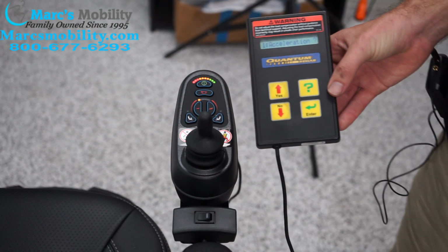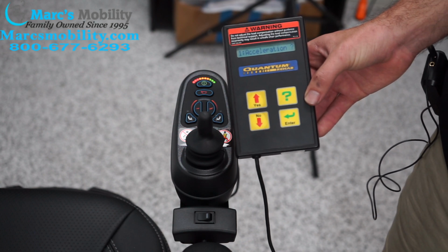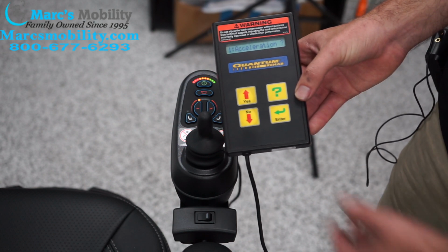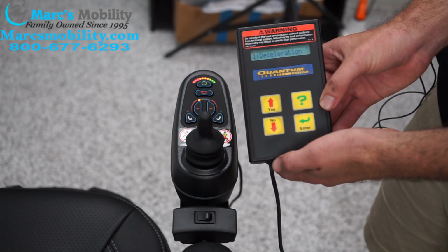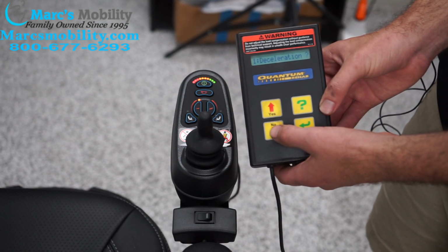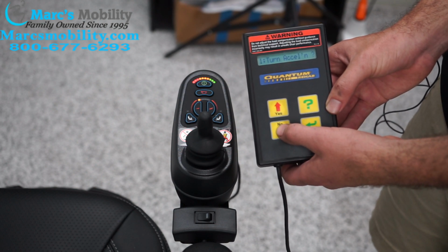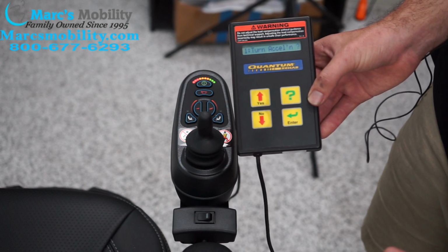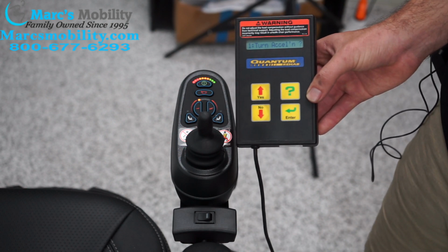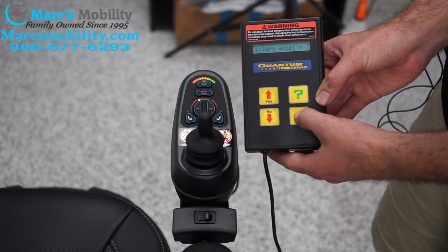So we have acceleration is the first thing you see. That is how fast the chair will get up to its maximum speed. We have deceleration, which is how fast the chair will stop when you let go of the joystick. We have turn acceleration, which is how fast the chair will get up to the top speed while turning. Now the Jazzy Air 2 can sometimes be kind of fast on the turn at the lowest setting. So if I want to edit that, I will hit enter.